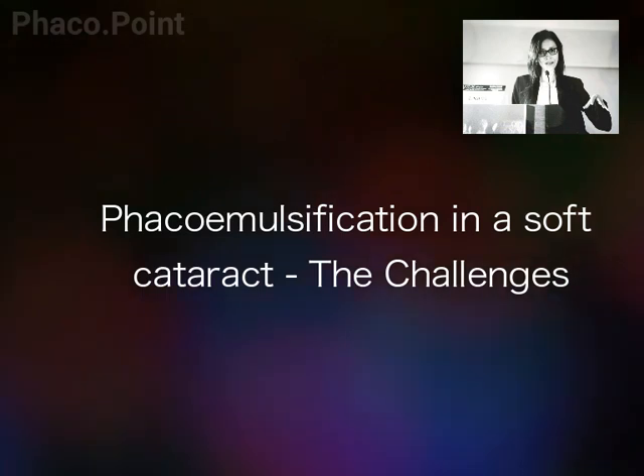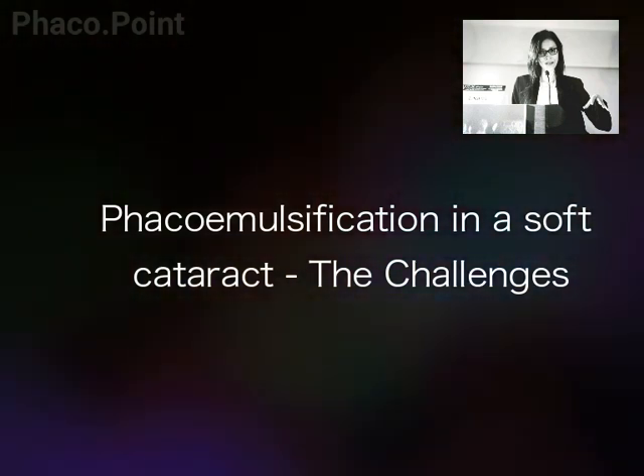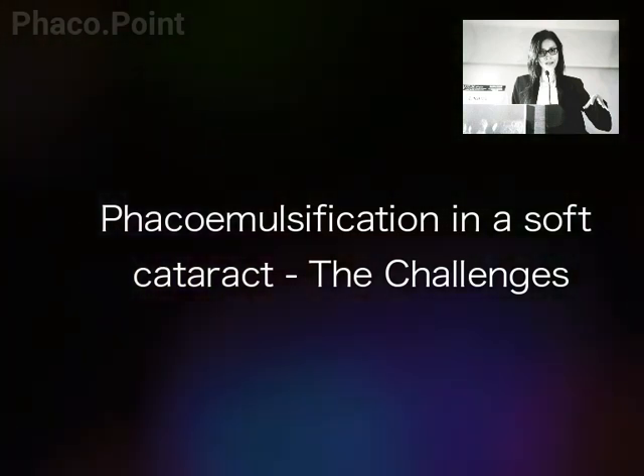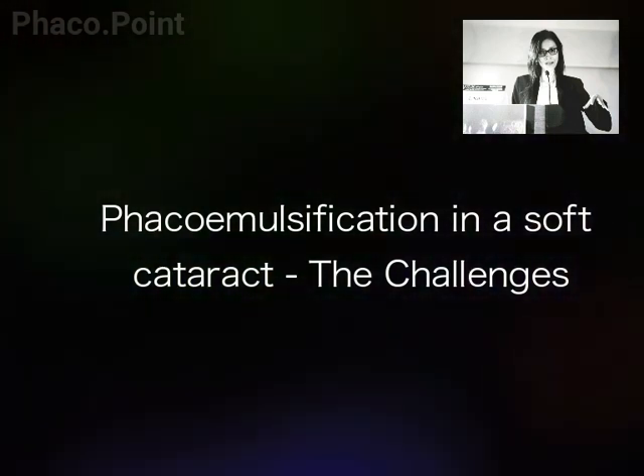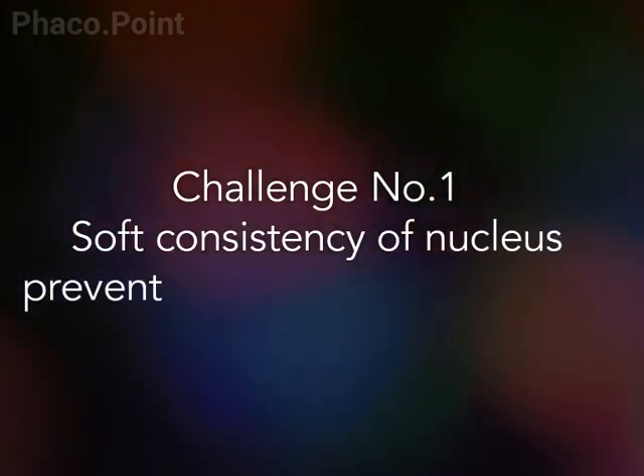The following video will depict the challenges faced by a surgeon whilst performing a phaco emulsification in a patient with a soft cataract. These soft cataracts pose significant challenges.